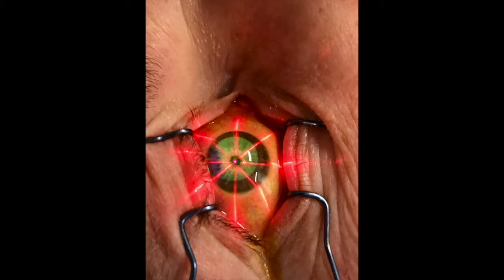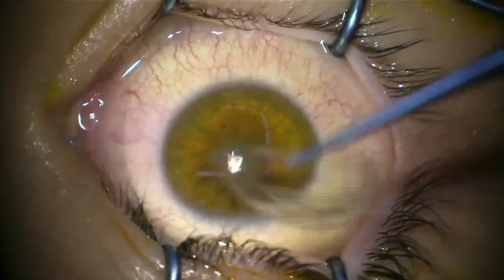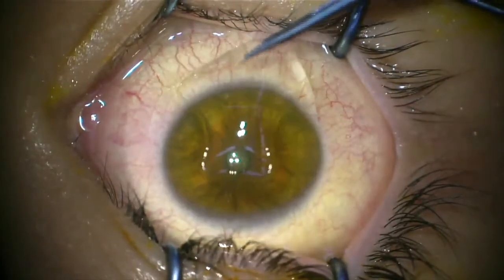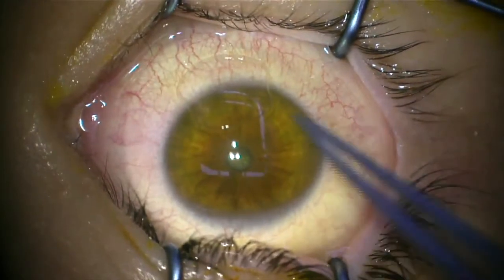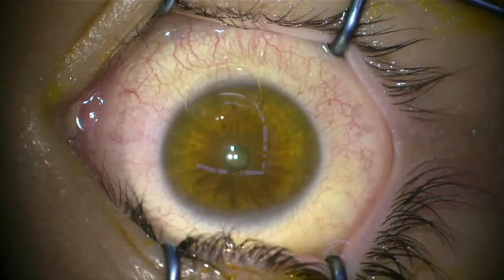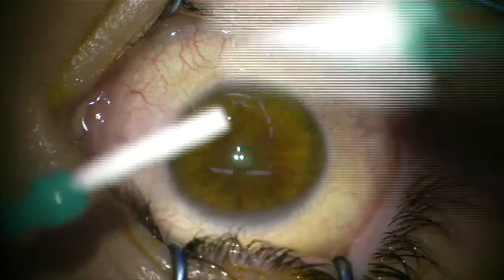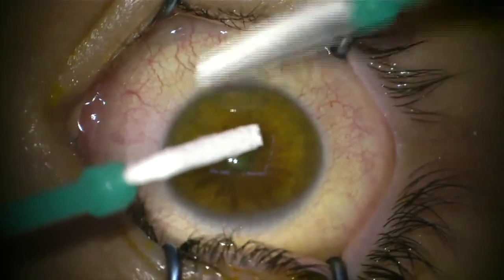The procedure itself isn't uncomfortable, but afterwards you really can be very uncomfortable and sometimes quite painful. We'll do everything we can to reduce that pain for you. We use a special bandage contact lens soaked in an anti-inflammatory medication — you can see that going on in the eye here — to try and reduce the pain. We'll give you lots of analgesia tablets and even analgesia in a drip. A lot of people say it wasn't as bad as we warned, but we do like to prepare you for the fact that you probably won't do much for a couple of days after the procedure.